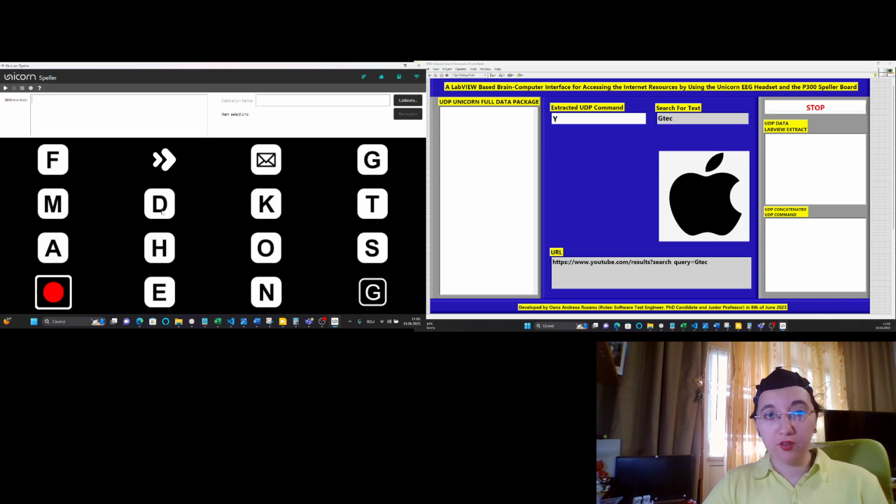Here we can see the abbreviated descriptions. Then we can search for some famous character animations from movies. For example, Avatar, Harry Potter, Yoda, or The Sims. The Sims is a video game.